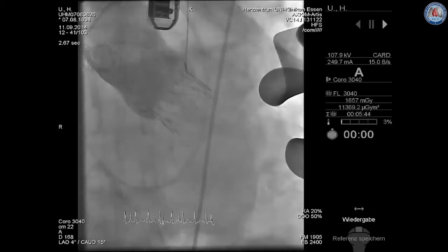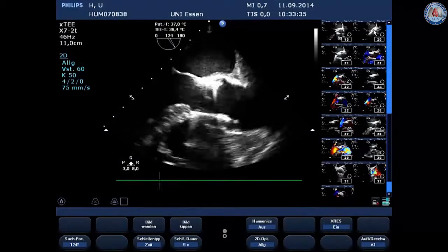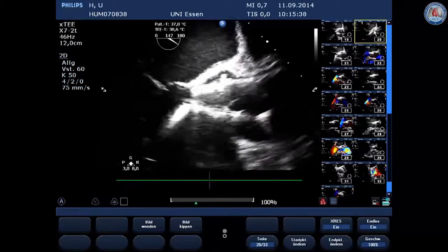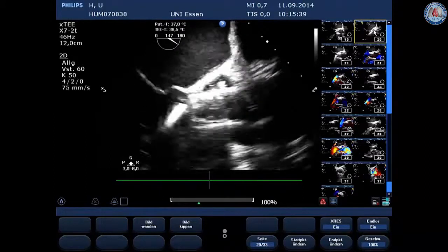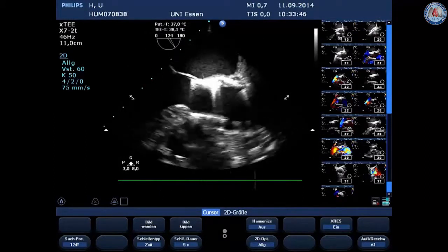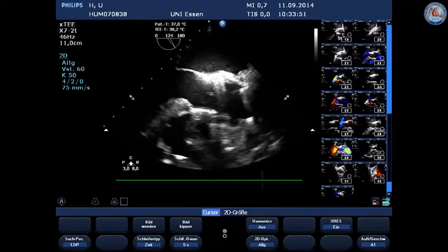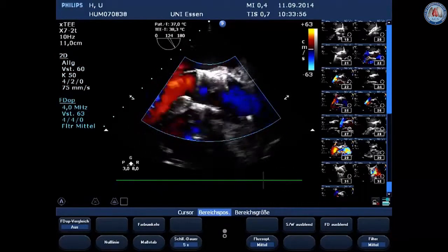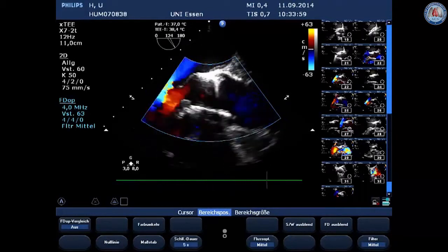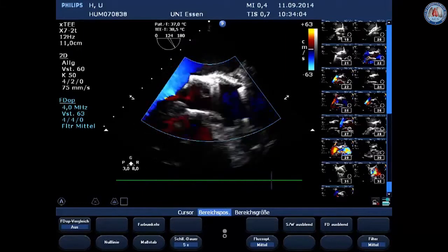Then looking to the echo, Ms. Eismann, please, can you comment on that? We just have to show you that because it's beautiful. Here you can see the deployment of the valve, the way it was released. And now I just switched to the live mode. This is live pictures. And you can see that the valve is perfectly fitted to the wall. And it just fits in there beautifully. And adding color to it. So this is proof that it really is an absolutely beautiful result. And I definitely agree it was worth the time, I think, right?